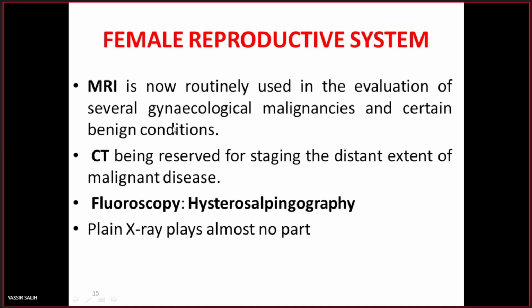MRI can be used for evaluation of this condition. CT يعني not usually done for assessment of the gynecological abnormalities and usually reserved for the malignant diseases.